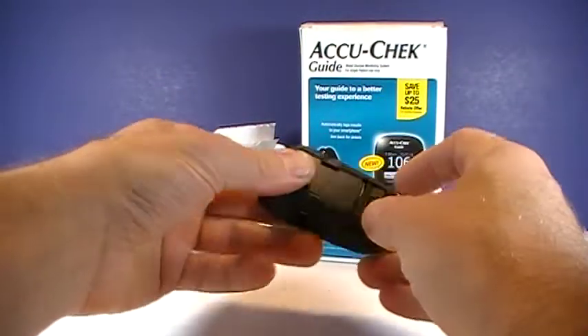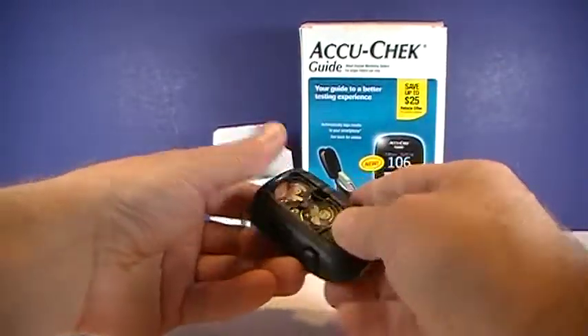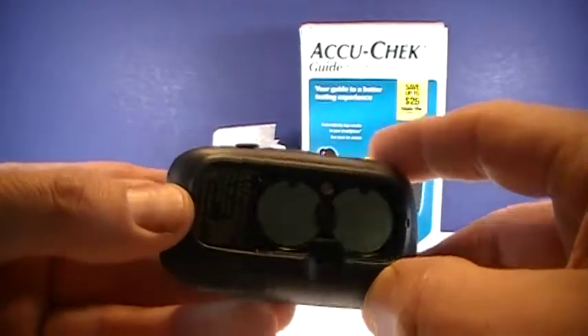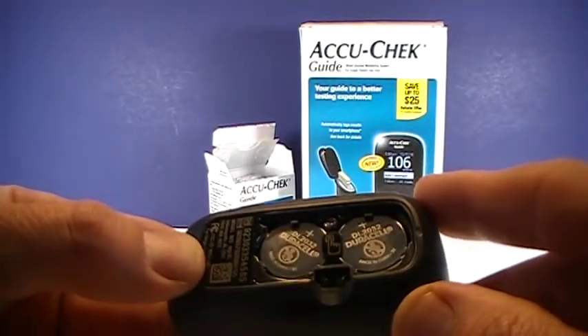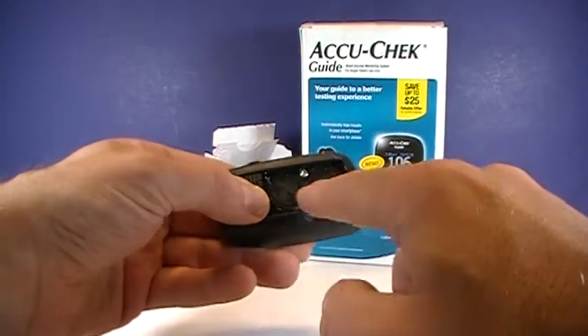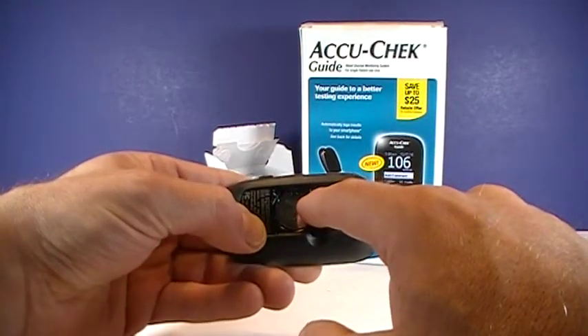First off, the battery pack is on the back, so all you do is you push that. Inside there, of course, you'll see the two batteries, and like many popular meters today, they use the 2032. And this one's pretty simple — you just push that button in the middle, with the little pictogram indicating as such.